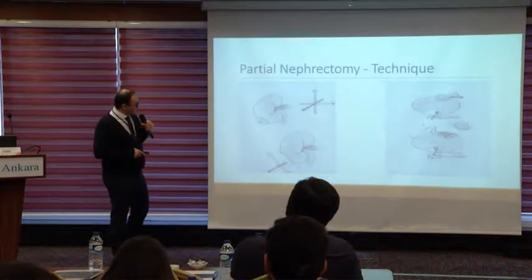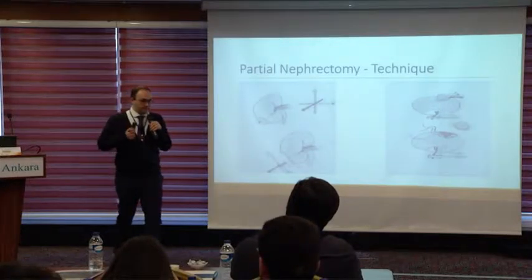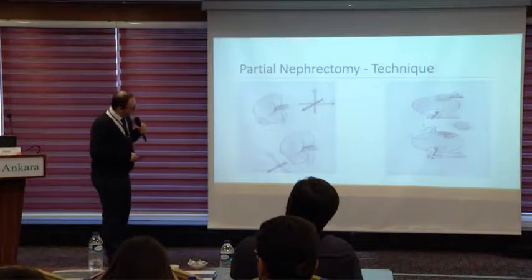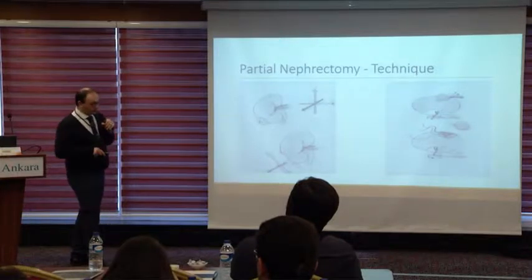Now, my trick that I found while performing this surgery in rural hospitals was based on the dimensions. Now, I start at this point my suture with my needle holder at this point.